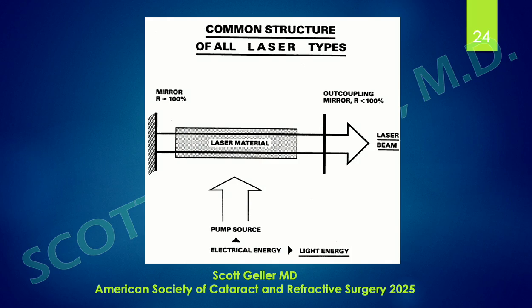There are mirrors at both ends of this man-made material, and these mirrors are 100% at one end and less than 100% at the other end. And when the light travels, and I'll go into that in a minute, it comes out of the outcoupling mirror and you get the phenomenon of a laser light beam.